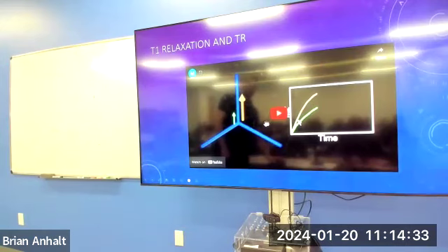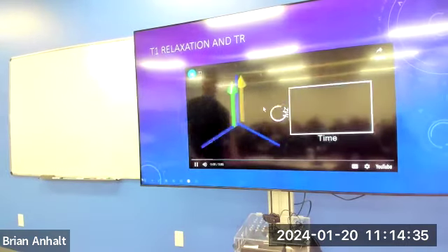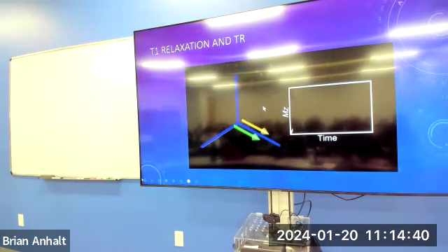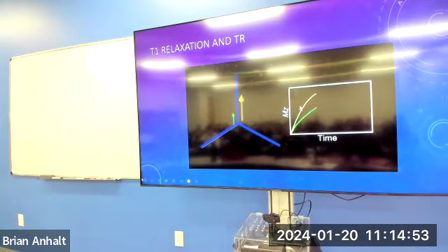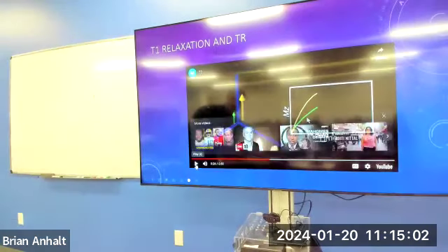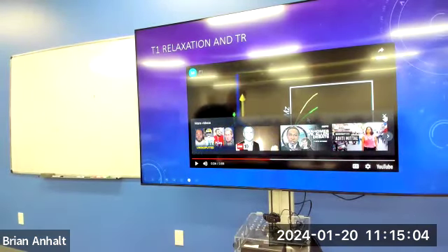Check it out, video. Down into the longitudinal axis, into the transverse plane. We've given them identical T2s because we can, because it's graphics. So they decay away at the same rate in the transverse plane, but we've given them different T1s. So in this sample, we've given the yellow tissue a rapid T1, the short T1, and the green tissue a longer T1. So between those two, yellow and green, which one's fat, which one's water?